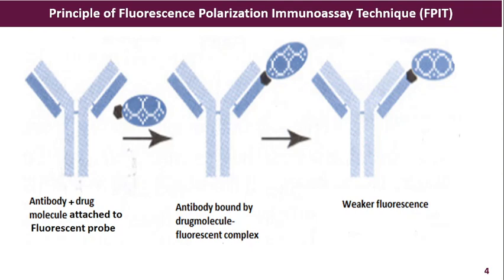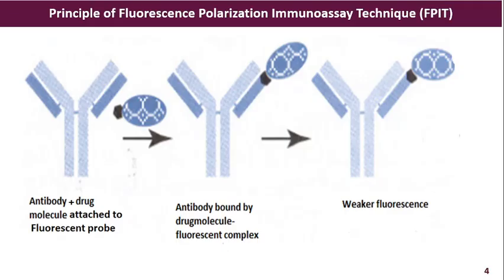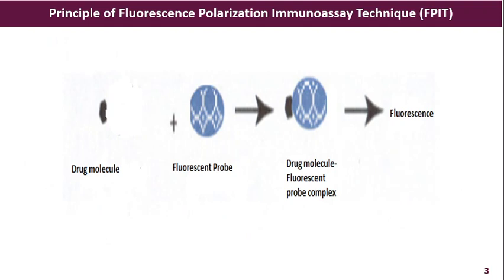Therefore, the drug fluorescent molecule complex will be available freely and the fluorescence shown by that will be as in the previous case when you prepared the drug molecule fluorescent probe complex.